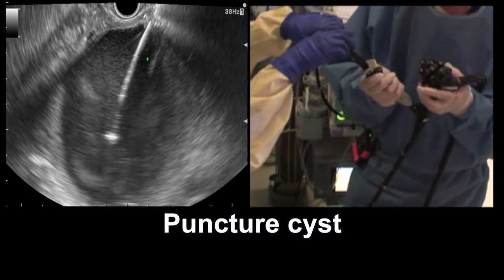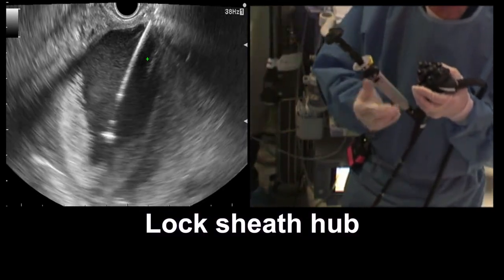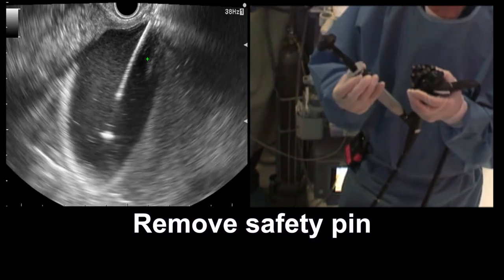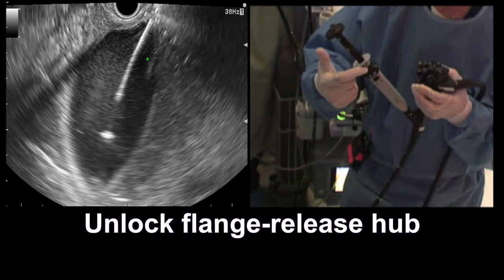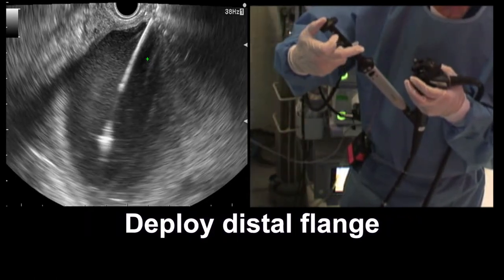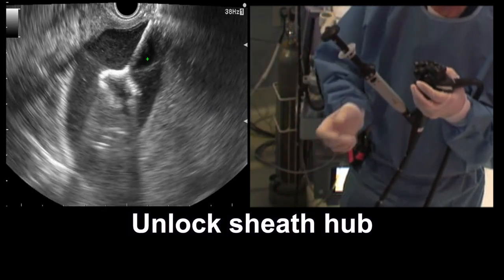We're going to advance the sheath all the way to its maximum, and then lock the sheath. We're going to take off the safety pin, and now unlock the gray hub — this releases the distal flange. We pull back until we hear a click, and it will automatically stop after the distal flange deploys.